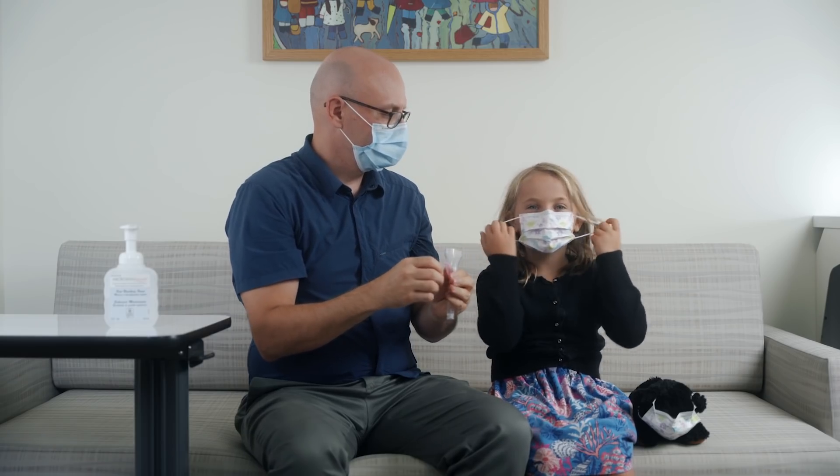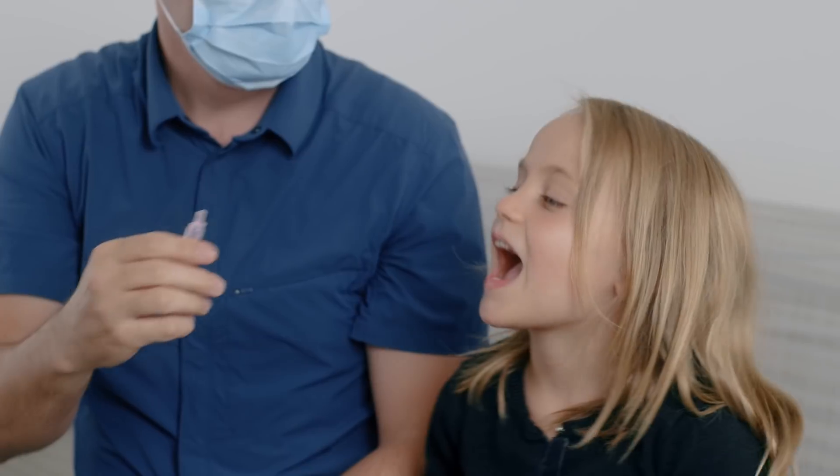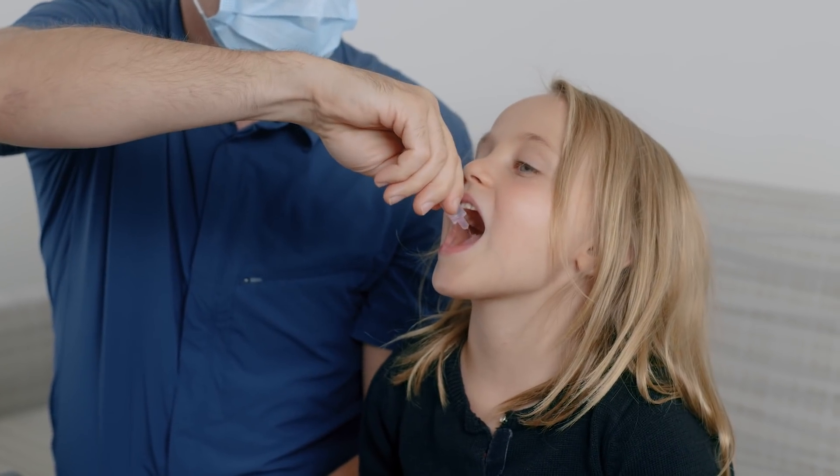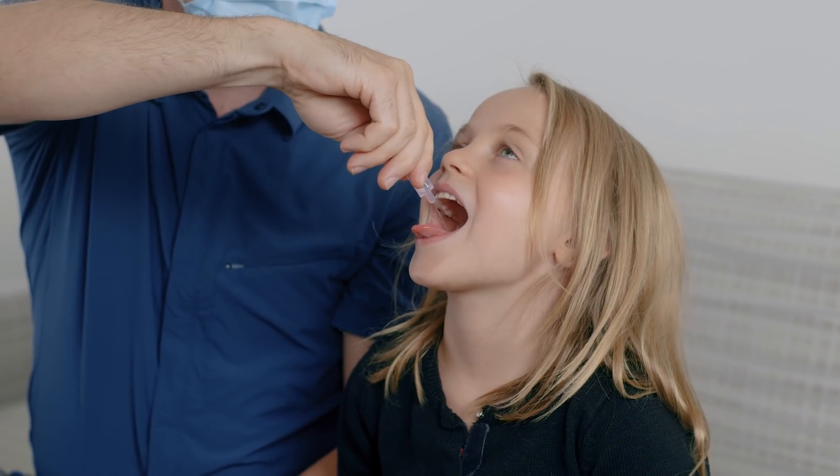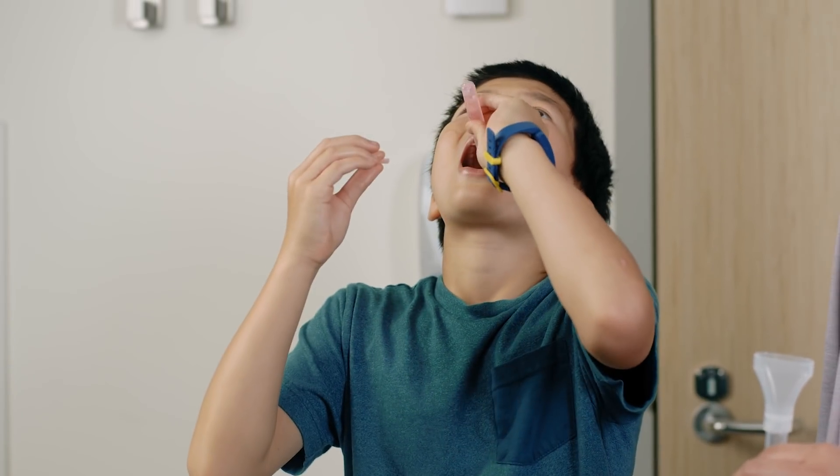Have the child remove their mask and hold it to the side. The child tilts their head back and opens their mouth really wide. Firmly squeeze all of the salty water into the child's mouth. The water will taste salty, like the water in the ocean. Some children may do this on their own.